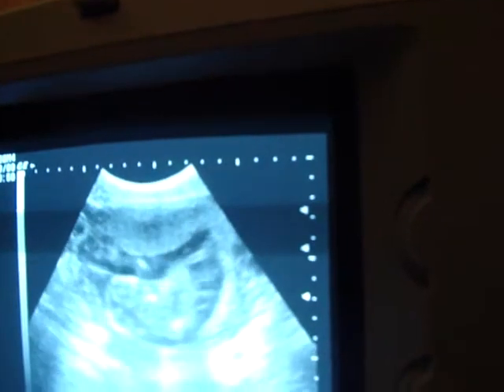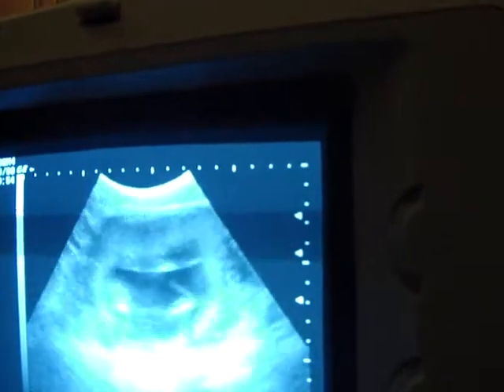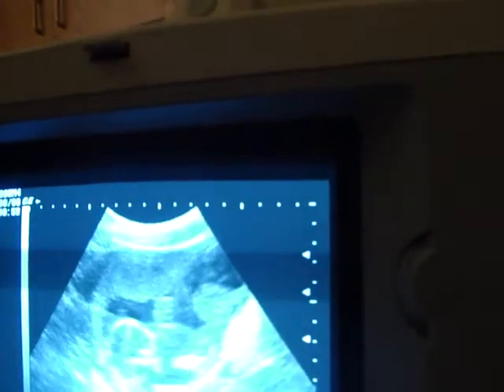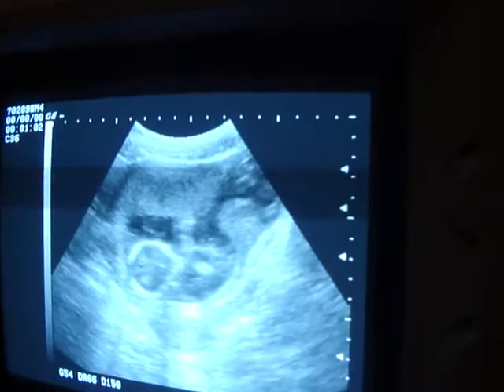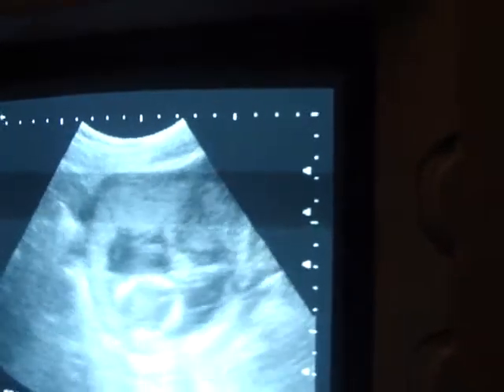Move just right — maybe you're old enough to tell us what you are. He is active, he or she is very active. Trying to get a profile of that face if I can. I don't think I'm going to get a really good profile here because the baby's looking backwards.